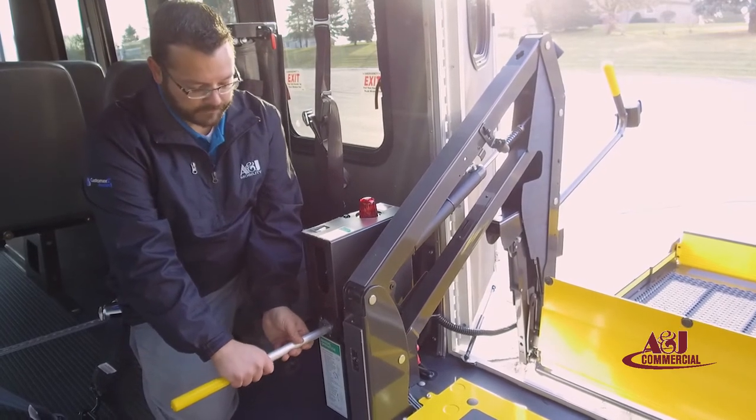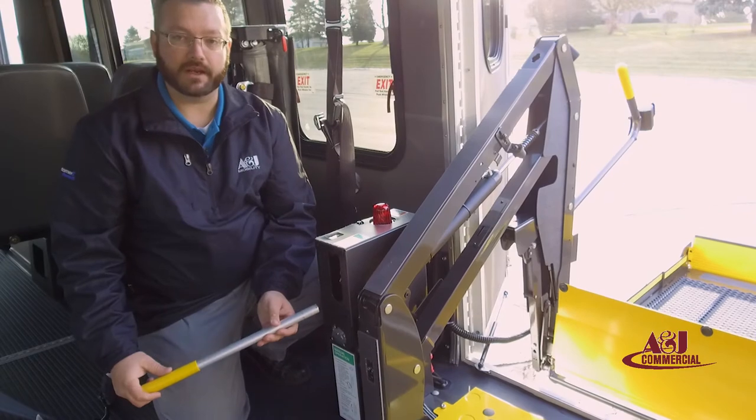Once you've gotten the lift down, tighten it and that will make sure that you can now get pressure.